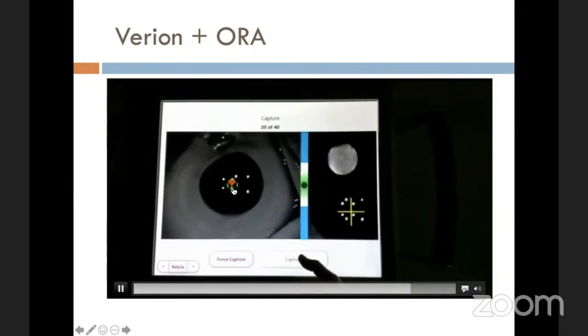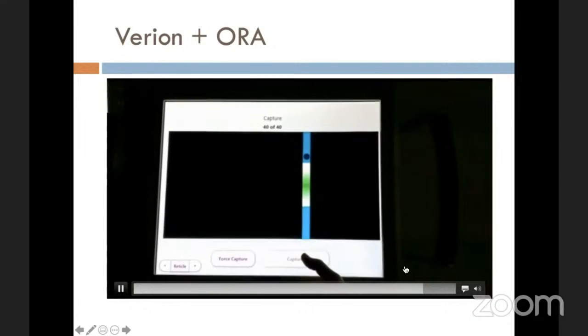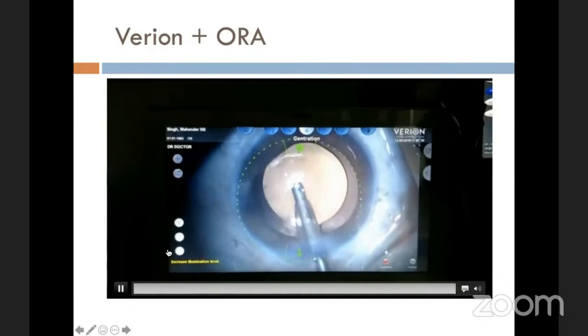So this green thing has to come inside this green basket, and when that comes, then you know that you are completely focused. And again, the endpoint will be something like this, no rotation required. So we've confirmed on 2 instruments now.